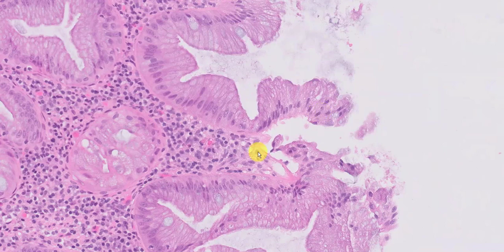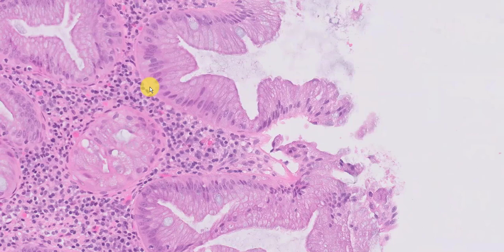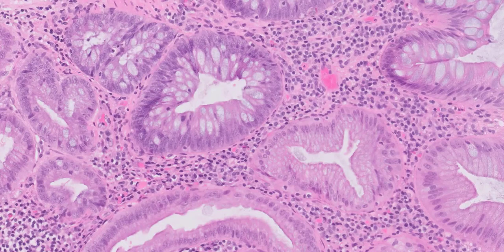Another feature that perhaps is not as well represented here is that the hyperplastic polyp is often associated with a thickened basement membrane. Here, the basement membrane looks slightly thickened but isn't quite as prominent as you typically see.